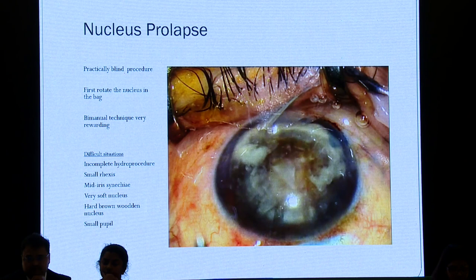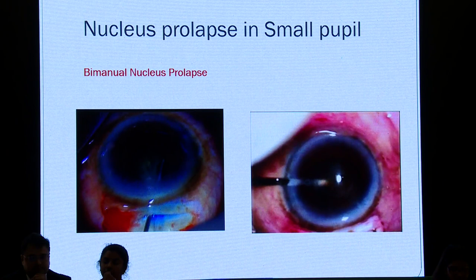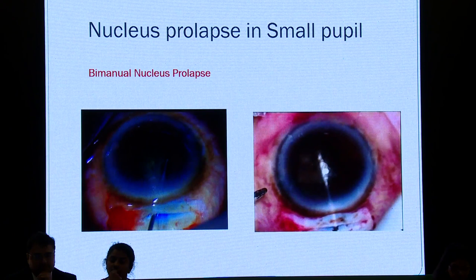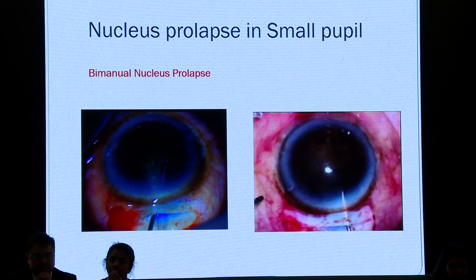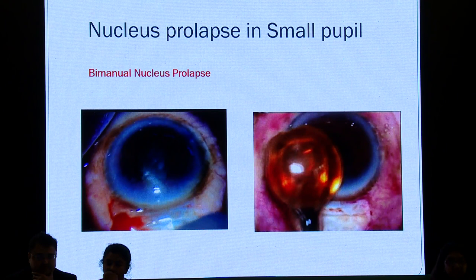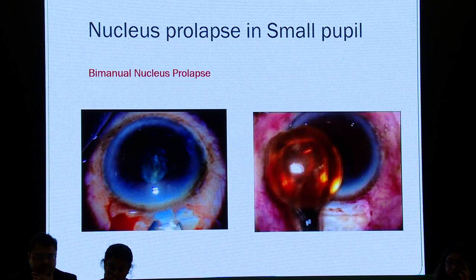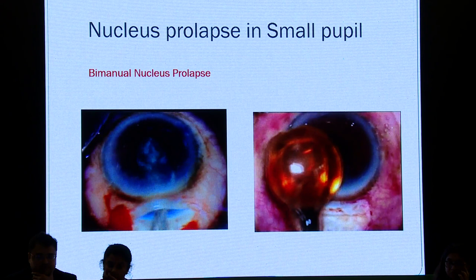With a hard brown wooden nucleus, the periphery will be very sharp, so it's very important that you inflate the bag with a lot of viscoelastic so the calcified area doesn't nick the peripheral capsule. This technique is demonstrated by Dr. Ramakrishnan of Tirunelveli Aravind Hospital. He uses the bimanual technique — spatula through the side port, lifts one pole out of the bag, then rotates the whole nucleus into the anterior chamber. In a small pupil, you'll find you have to rotate the nucleus comfortably, and viscoelastic is injected again, hydrodissection is repeated, and the bimanual procedure is attempted. Cheese wiring can happen, especially if you misjudge your nuclear density.